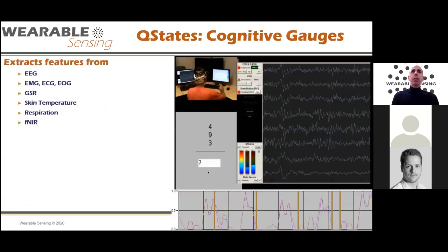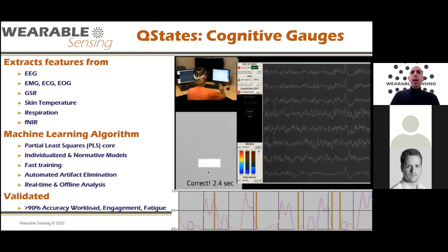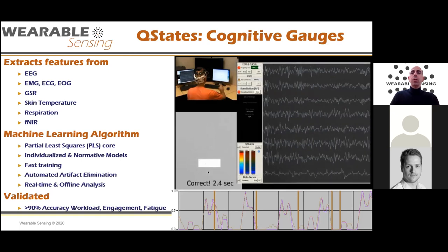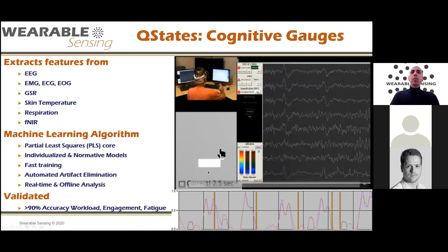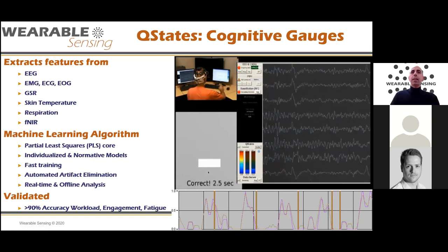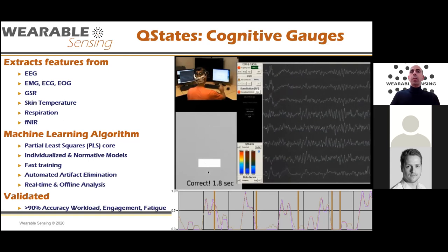We also developed an algorithm to produce cognitive gauges from EEG data. We take EEG, EMG, GSR, skin temperature, respiration, and fNIR data and feed them into a machine learning algorithm that extracts features and trains individual or normative models. Here, a person is doing math problems. You can see gauges for mental workload and disengagement — the person is engaged, attentive, and solving problems quickly, so workload is low.